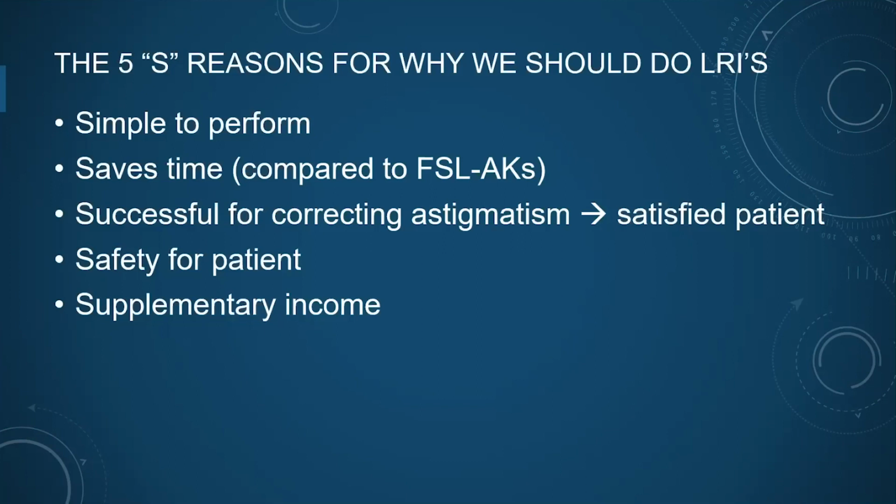Those of you who've done femtosecond laser cataract surgery know that it takes much more time to do these cases than your routine manual cases for most surgeons. They're very successful for correcting astigmatism, and that leads to a satisfied patient. They're very safe, so there's safety for the patient. And finally, it can provide supplementary income. Certainly, I believe Pat Reichert will talk a little bit more about that towards the end.